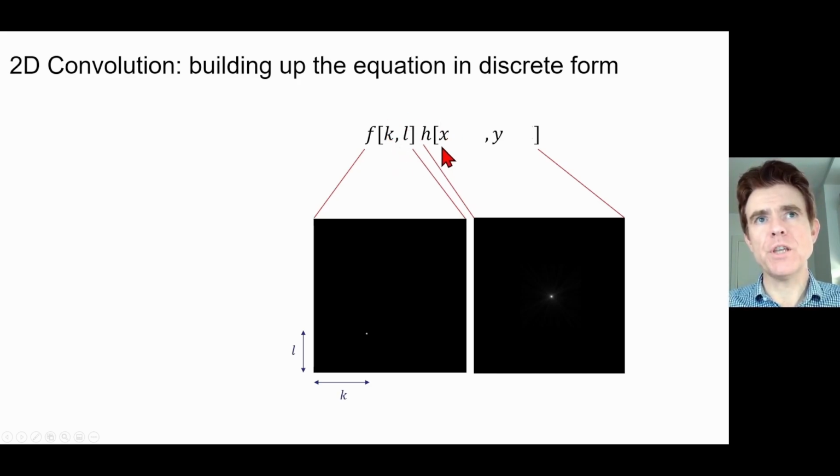And then what we're saying is we've got some point spread function, H, which could also be represented on a grid. Now here I'm using x and y. Please allow me to do that. I'm going to use x and y as also integer discrete coordinates along this 2D image here. So we've got h of x, y, and that's this function that is this point spread function with those tails that we've been seeing earlier.